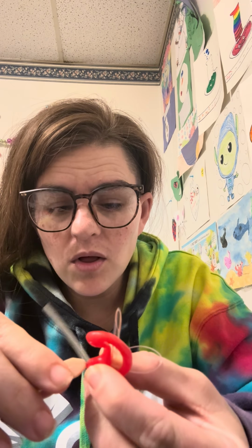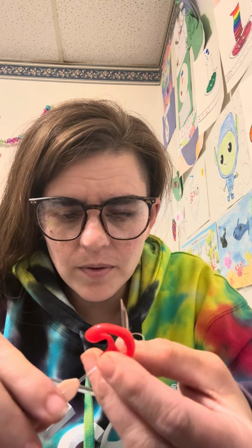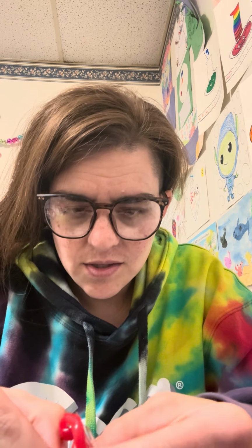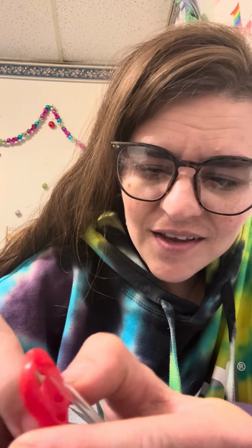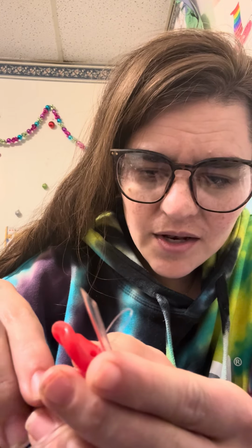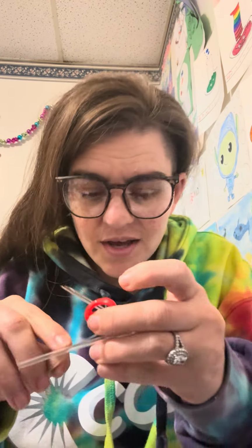And then you just pull the tube puller and watch what happens. Let me see if I can angle it so y'all can see it. Now watch what happens. I've pulled it taut. Okay, let me get it at an angle for you guys. Do you see? Hold on. See how this is out? Now this is out that way and this is through the loop. Now I'm going to pull it taut. Okay. Pull it taut. And you're going to keep pulling it taut.